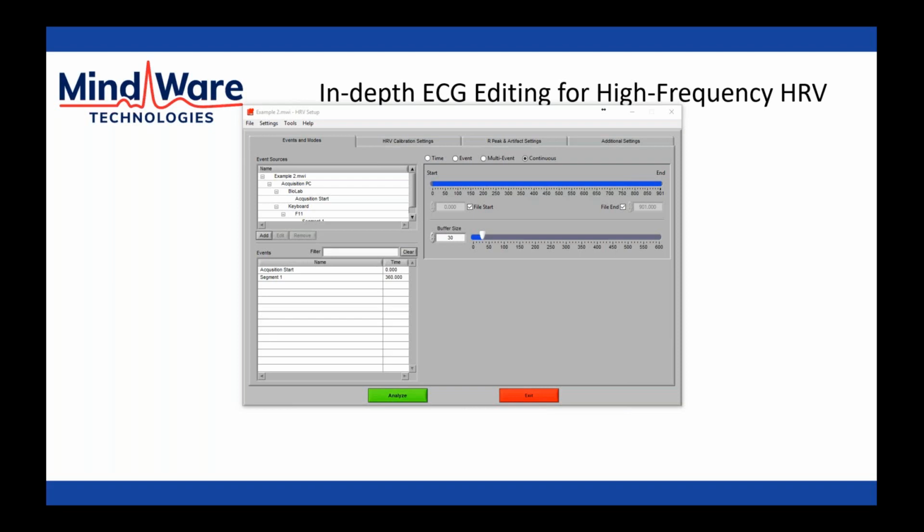Okay, so the next question is related to arrhythmias. The question is, when the patient seems to have an arrhythmia and the R peaks are correctly detected, however, they're detected as yellow stars due to the varying distances, is keeping the yellow stars okay if the R peaks are properly defined? So that basically is just that example that I went over.